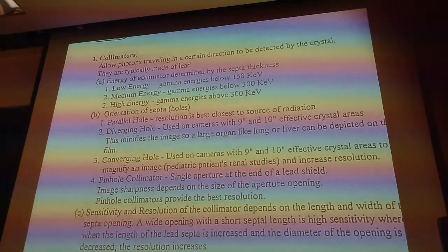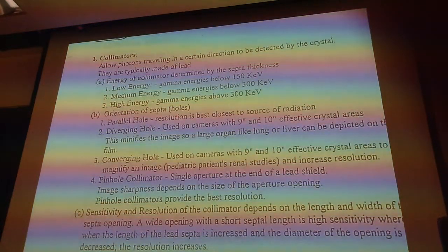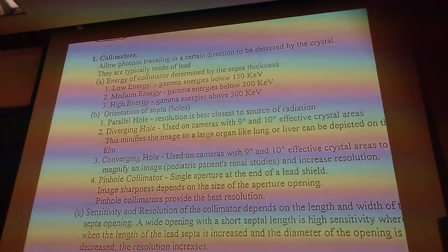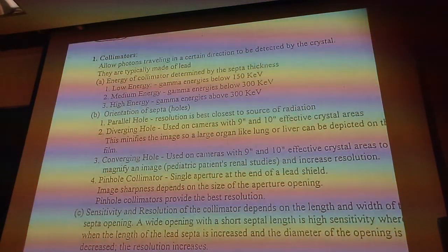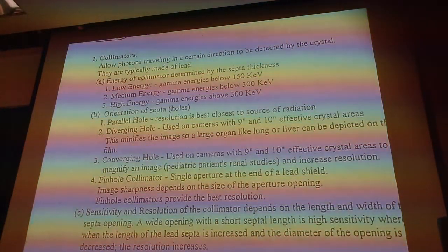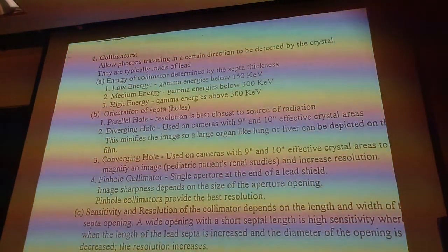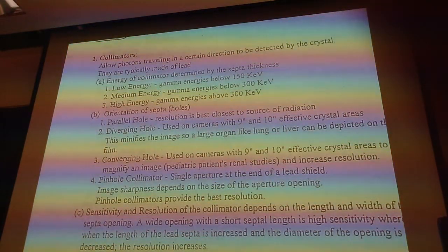Since you usually use high energy for high voltage, probably not the energy level. It has a higher energy and a higher voltage. Okay, so you're saying then that the collimator is what determines what energy of radiation reaches your crystal? Is that what you're saying? Ms. Monica, what are you saying? Photons traveling in a certain direction, the angle of it. Okay, that's exactly what it does.